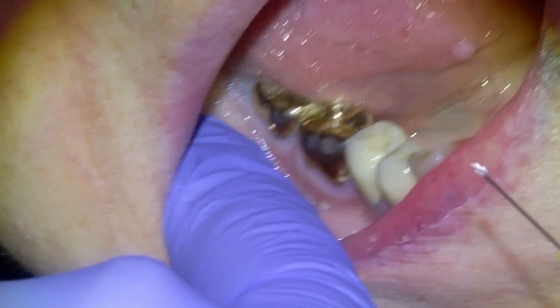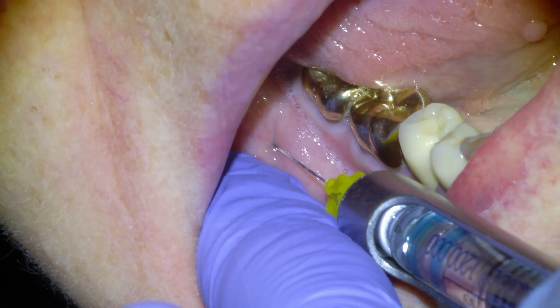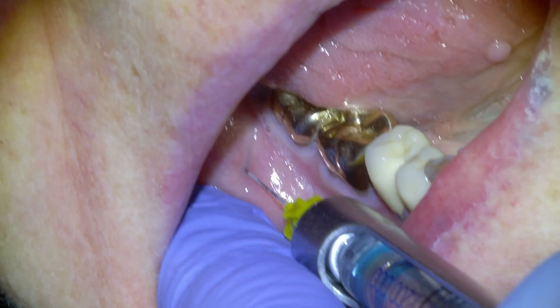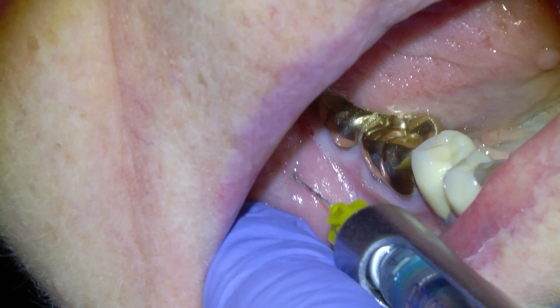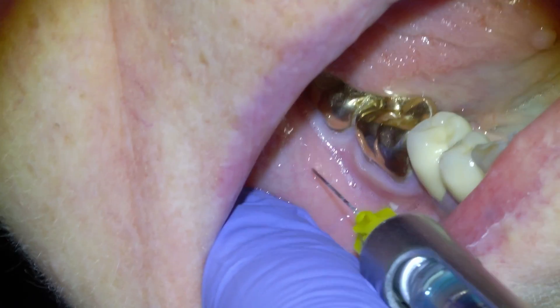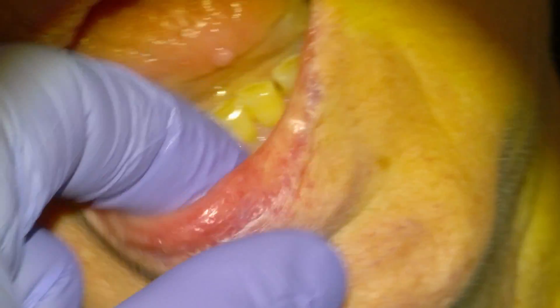The other super important thing is to not give the long buccal block anywhere near the mental foramen, because then the lip and chin is going to go numb anyway from the infiltration anesthesia. You won't know whether the lip and chin is numb from the block or from the infiltration. So if you're working on premolars, leave the infiltration alone until you have the lip and chin sign from the block. That's pretty much how I give a standard block — I'll show the chair setup in another video. Feel free to leave any questions in the comments.